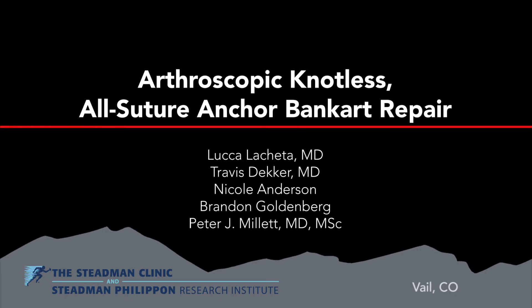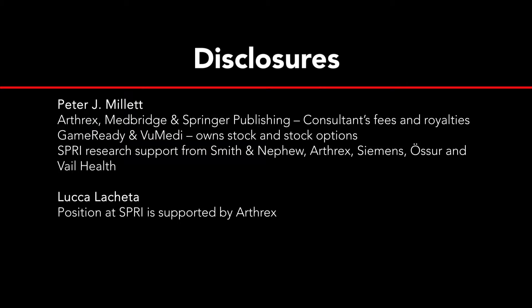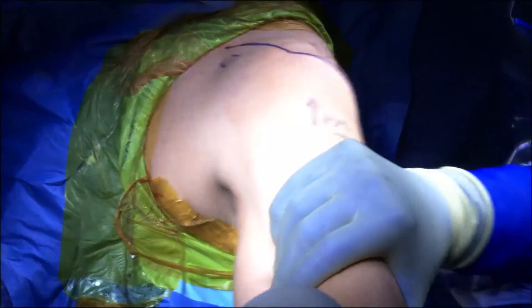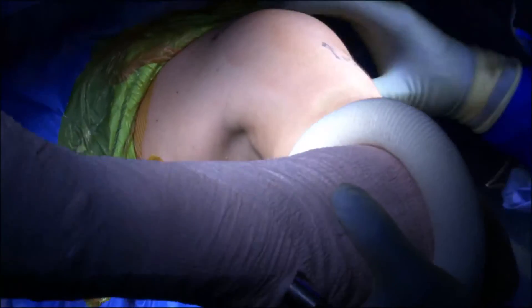This is a video presentation of tensionable knotless all-suture anchors for an anterior Bankart repair. After the induction of general anesthesia, a thorough exam is performed evaluating for both posterior and anterior shoulder instability.